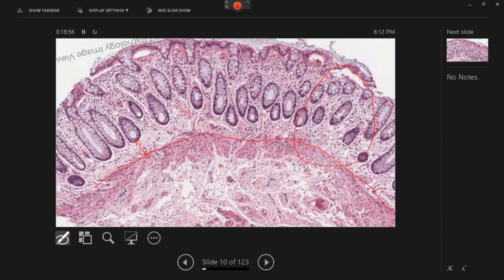And the crypt atrophy in general, if we remember together, we said that it can be a sign that there was crypt architectural distortion here that damaged the crypt, and when the crypt did regenerate, it did not regenerate with the same height, and then you end up with slightly less surface area, or this crypt shortening, which is one of the features of crypt atrophy.